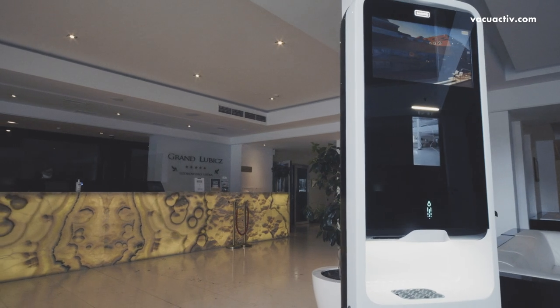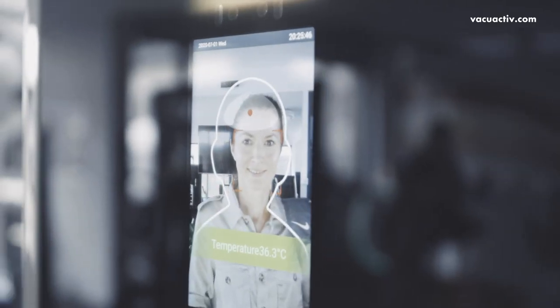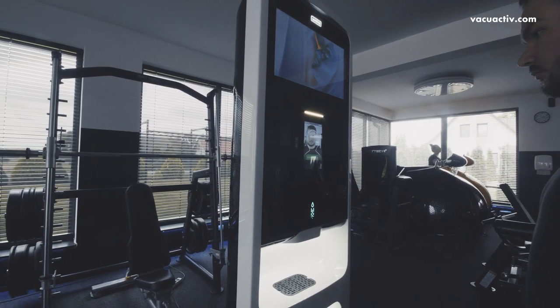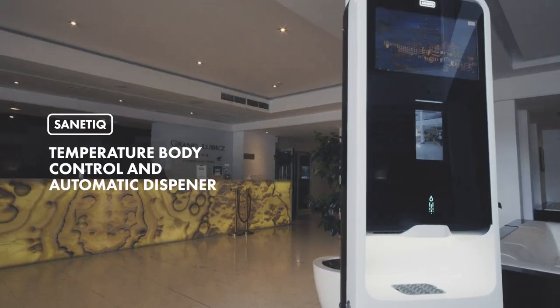This is the only station on the market that offers so many possibilities in one: temperature body control, hand disinfection, and ads display at the same time. This is the best solution to reduce the risk of cross infections in your workplace. Sanitique by VacuActive.